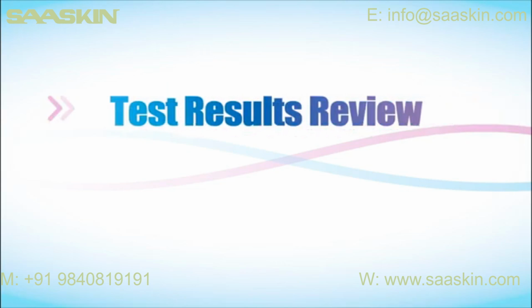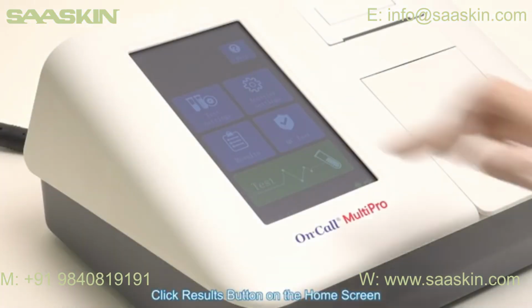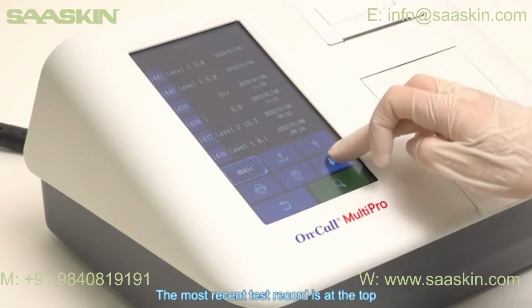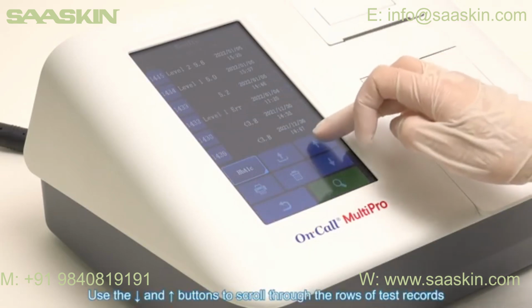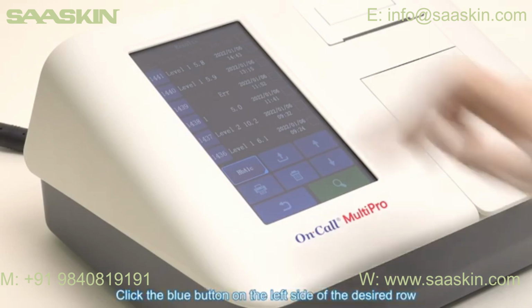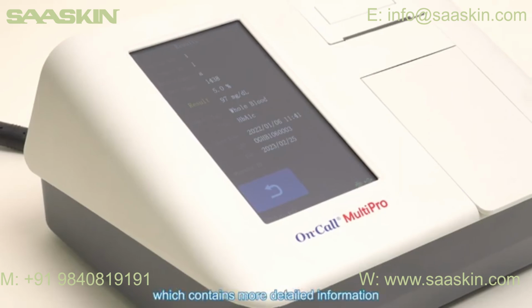Test results review. Click Results button on the home screen. The most recent test record is at the top. Use the down and up buttons to scroll through the rows of test records. Click the blue button on the left side of the desired row to open a full screen test record, which contains more detailed information.